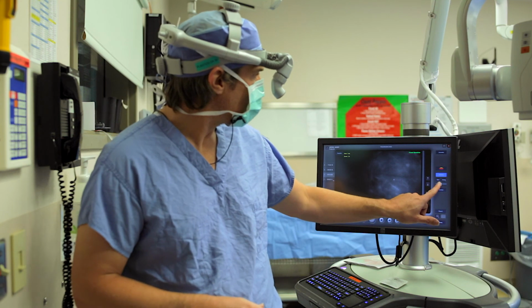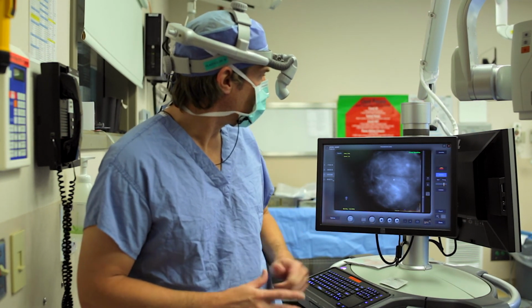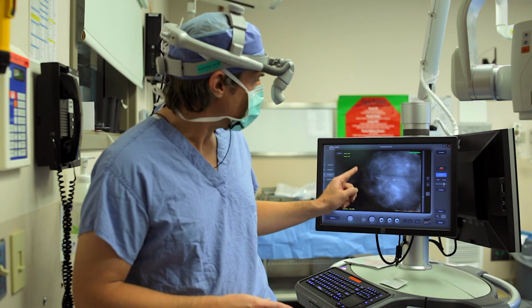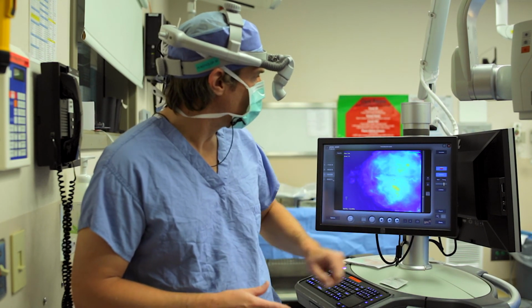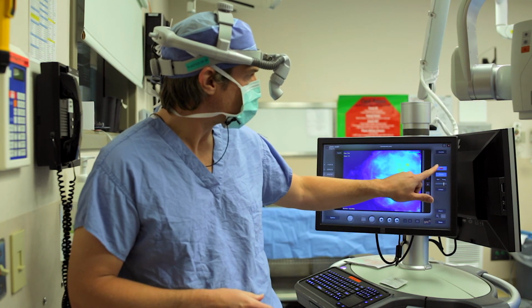So what we can do, again, to get the sense of this, I'm going to add a little bit of brightness to the screen. This part of the flap is perfusing well, this part of the flap is perfusing poorly. If we want to look at a color image, we can add in the color scale if you'd prefer to look at it in a color image.